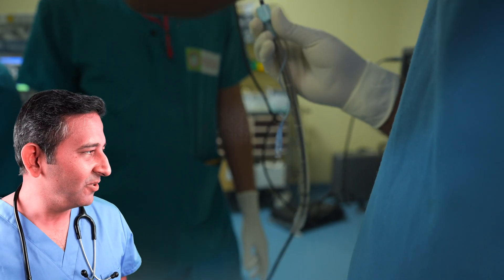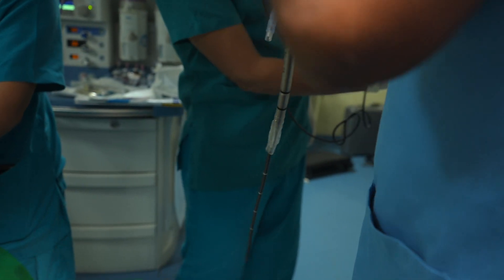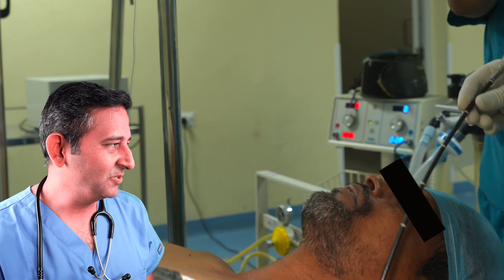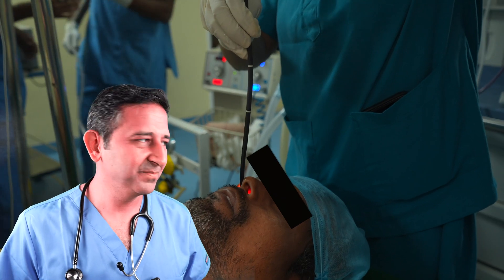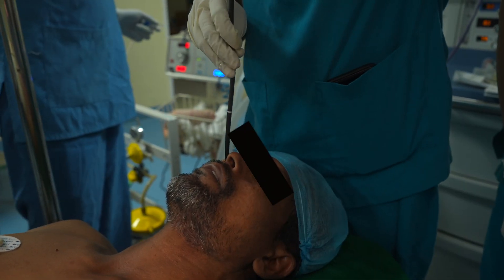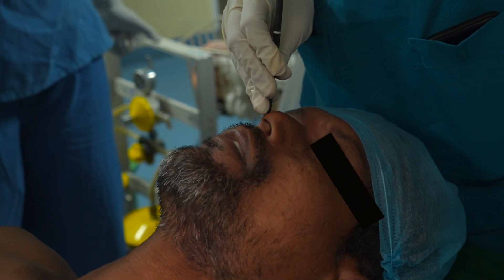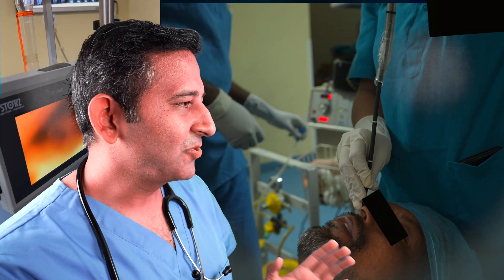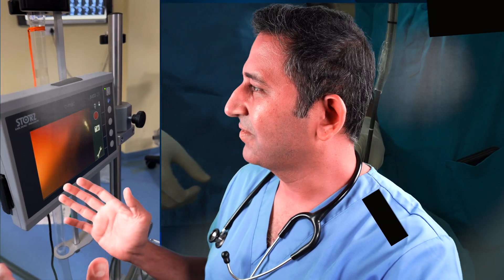Here is the breathing tube getting loaded on the fiber optic scope. The fiber optic scope is going through the right nostril. The ultimate goal here is to place the breathing tube in the trachea. As the scope goes through the nose and through the mouth, everything is going to be visible here on this screen.